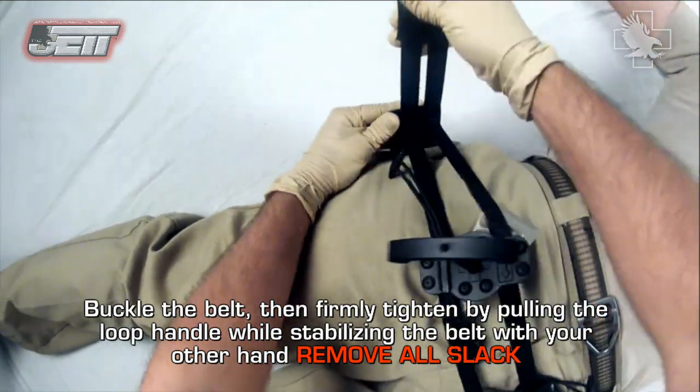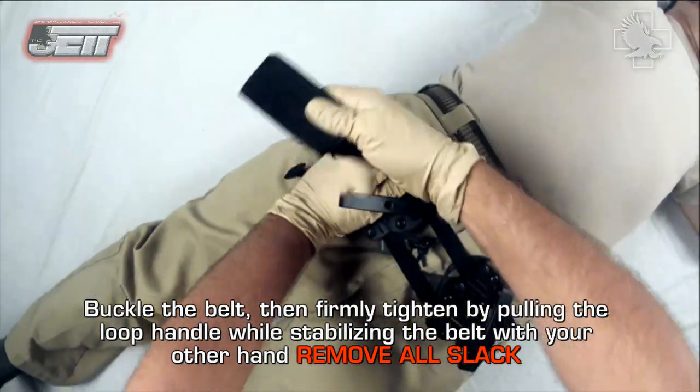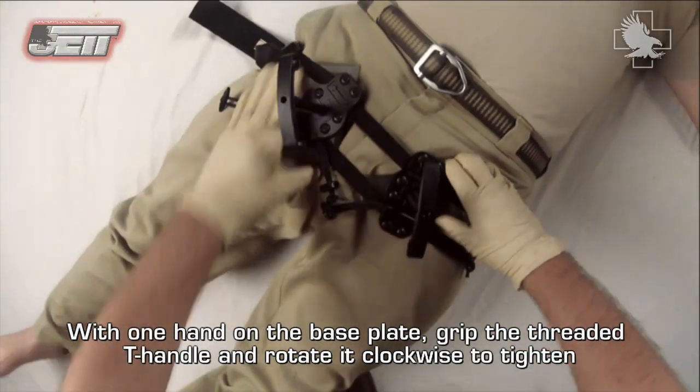Buckle the belt, then firmly tighten by pulling the loop handle while stabilizing the belt with your other hand. Remove all slack. Re-assess the pad placement to ensure that they are still in the correct location below the inguinal ligament.